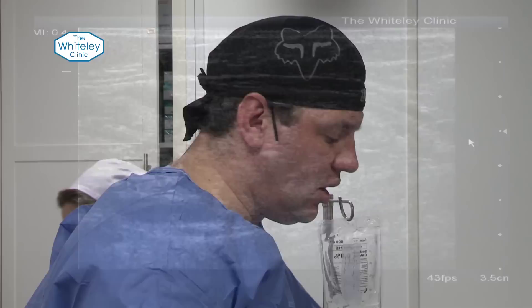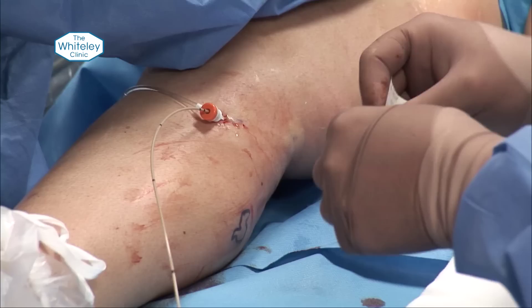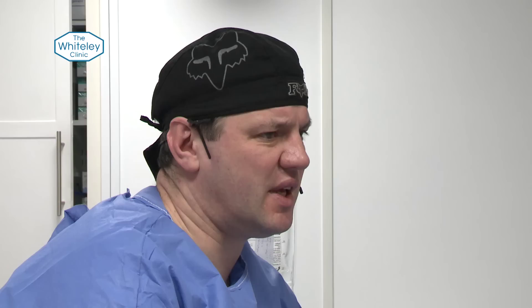For the RFITT device, because it's only marked every 10 centimetres and we need to bring it back to a set rate, we set it exactly where we want to. With the laser it fires forwards and we have to be careful, whereas with radiofrequency we know exactly where the burning is going to be.